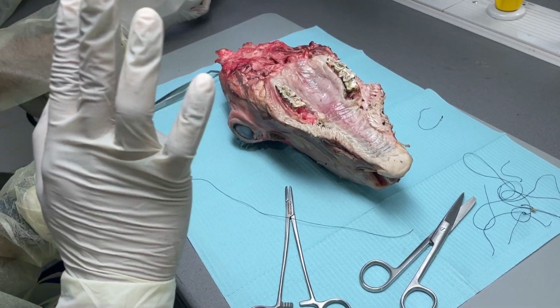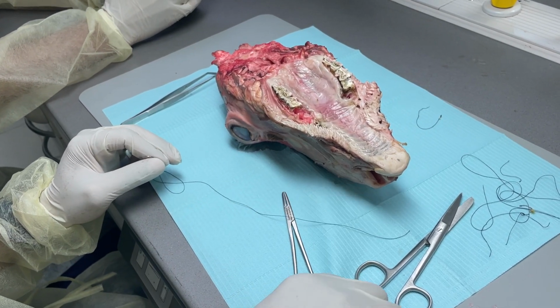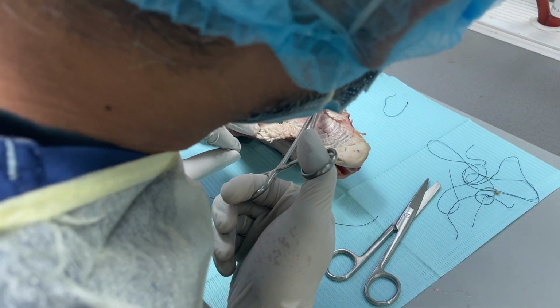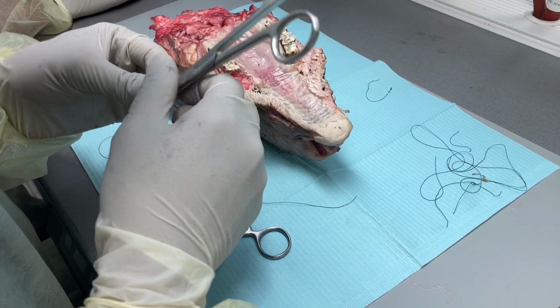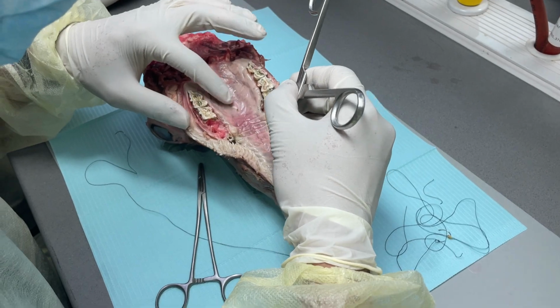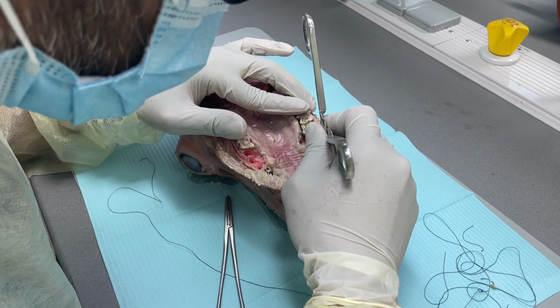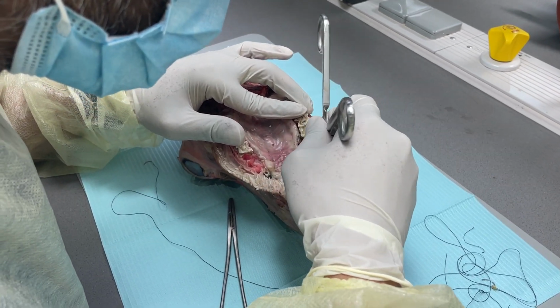Clear? So we did simple interrupted suture and simple interrupted figure of 8, right? Now this is an extraction. The tooth is still there. I think I'll show you here, but there is no tissue here. We can do it in this size, that's also possible, but it's better if we have the extraction socket. No problem. This is enough. This is fine.